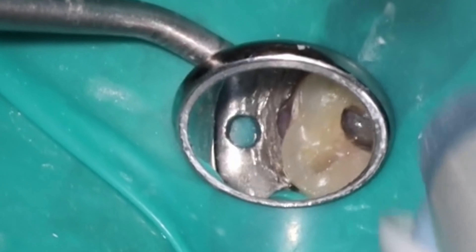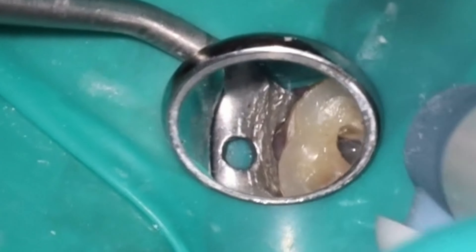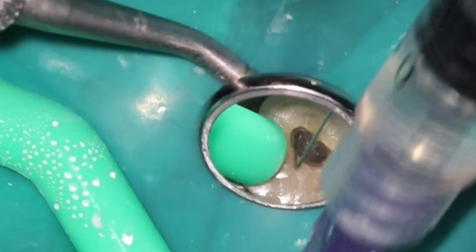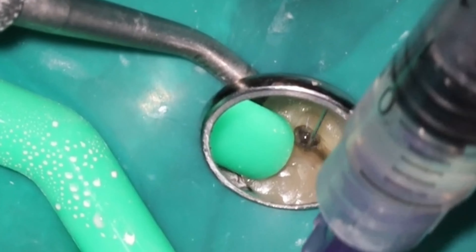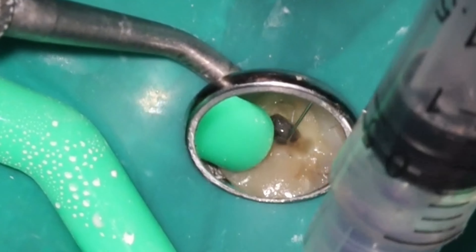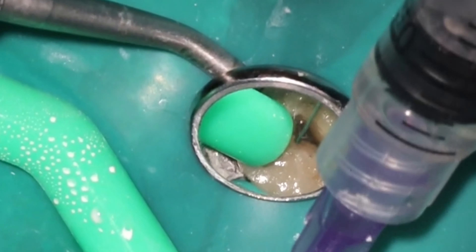You don't need to take a hand file down in every single case. Sometimes — and that's probably a case where I would have to do a lot of hand filing — is to fix work that's already been done. When it's ledged, the only real way to get around it is lots of EDTA, lots of hand filing, pre-bent, get around the corner, find a way around it, and then use rotaries as soon as you drop down.